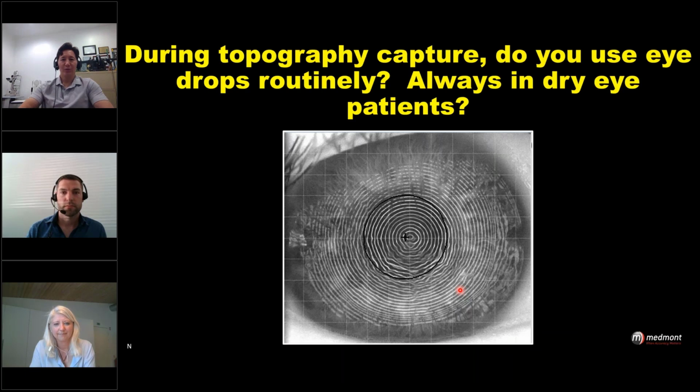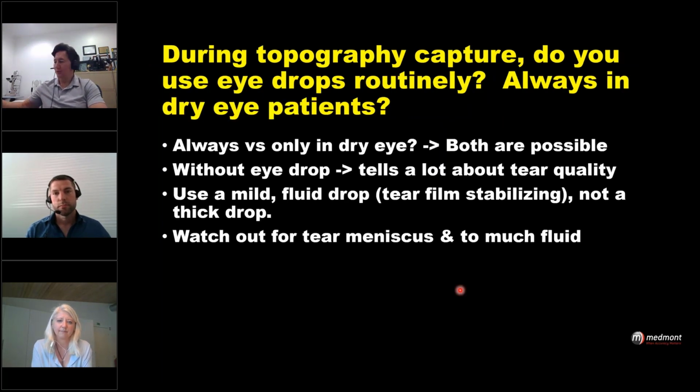Here's another question that comes up with great frequency all around the world. During topography capture, do you use eye drops routinely? Do you always do that in dry eye patients, as an example? So Nikki, could you take us through your thoughts related to using preservative-free artificial tears or any kind of eye drop?